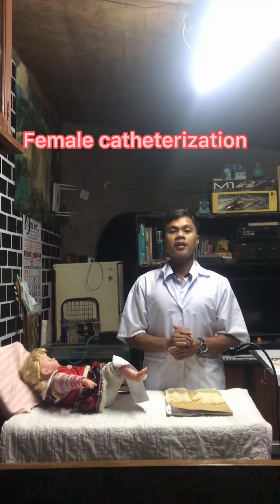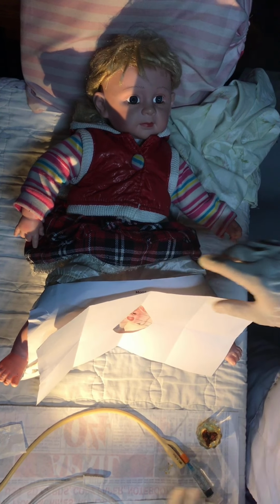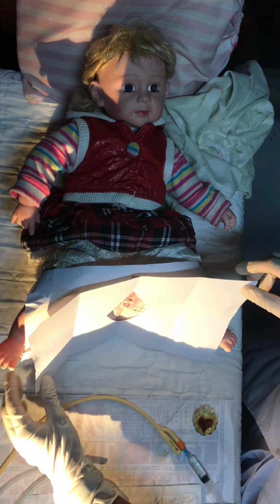This time is female catheterization. Same as male catheterization, identify the client, check the doctor's order, wash hands, don gloves, and explain the procedure. And now let's proceed to the insertion of the catheter. Same as the procedure earlier, put a fenestrated or eye drape on the client to prevent accidental contamination and to provide a sterile field. Place a fenestrated drape over the vulva and expose only the labia.